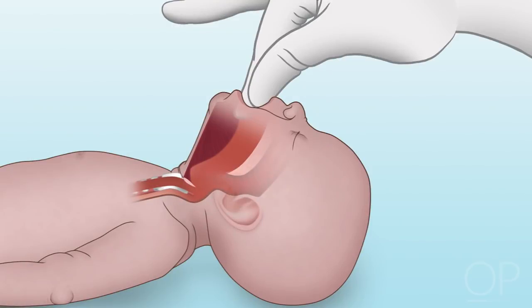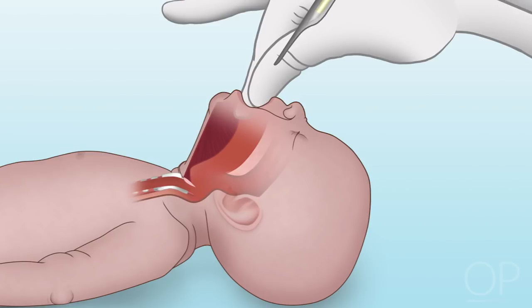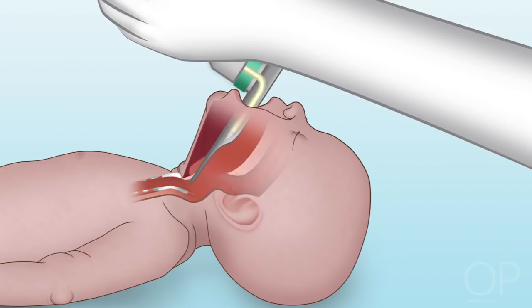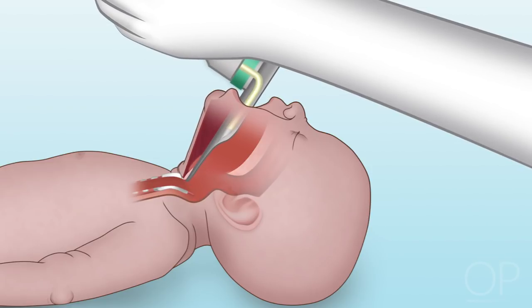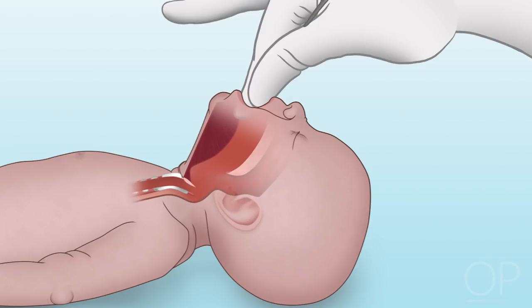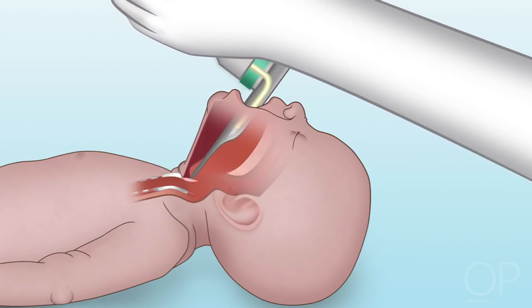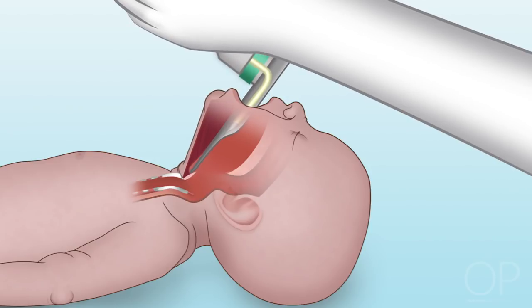There are two techniques to visualize the vocal cords. The first option is to use a straight or Miller laryngoscope blade placed directly on the tip of the epiglottis, gently lifting to compress the epiglottis against the base of the tongue to provide visualization of the vocal cords. The second technique is to advance the tip of the Miller blade until it lies in the vallecula just below the base of the tongue; when the blade is then lifted in the direction the handle is pointing, the vocal cords can be visualized.